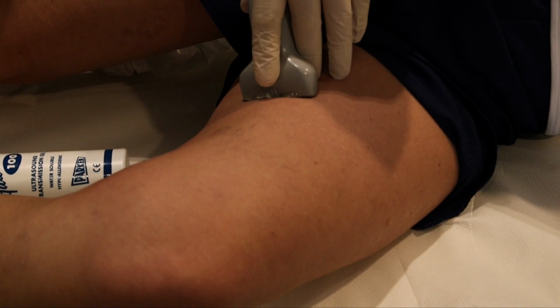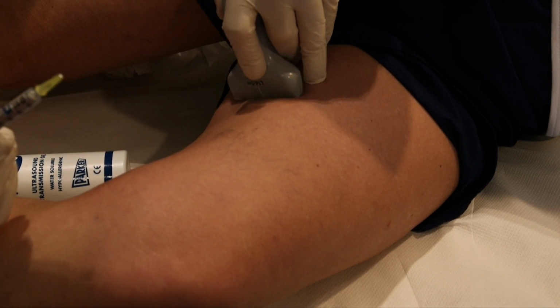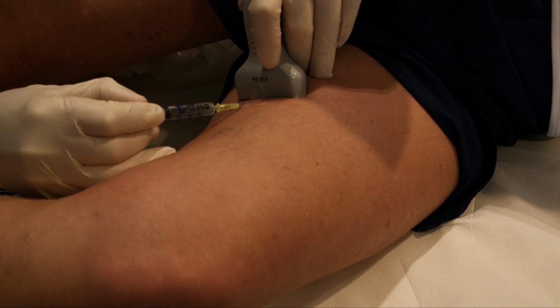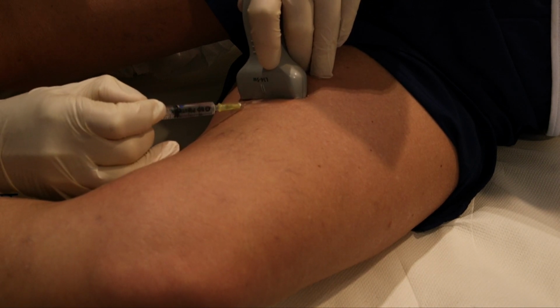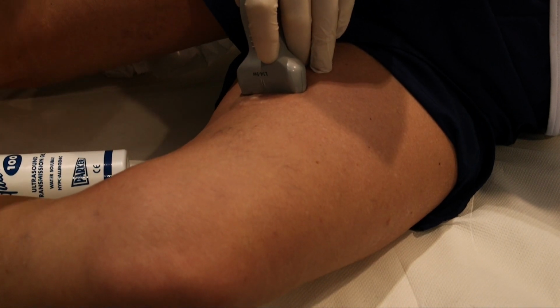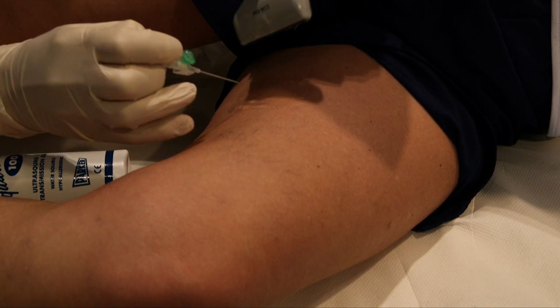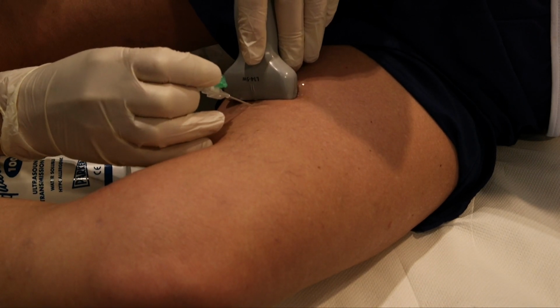Okay. So what we will do, I think, is cannulate that vein just there. So we're going to do a little injection of local anaesthetic. So Kate has added a quarter ml of bicarb to this syringe of lidocaine to make it less stingy when it is injected. That's Dr. Klein's solution.